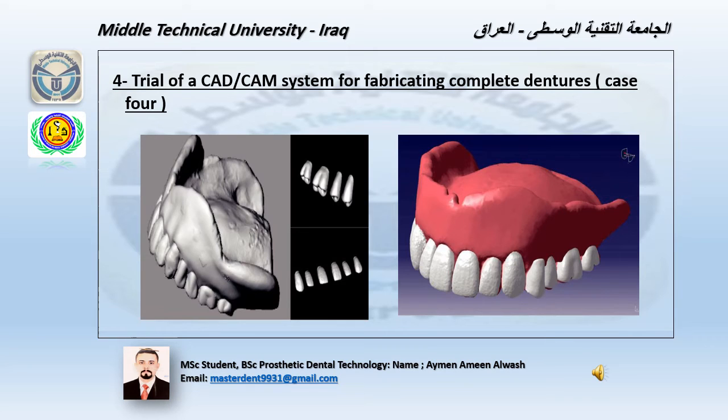From this point, we do 3D scanning to record all the details of the complete denture and transfer them to the specialized software of this system.